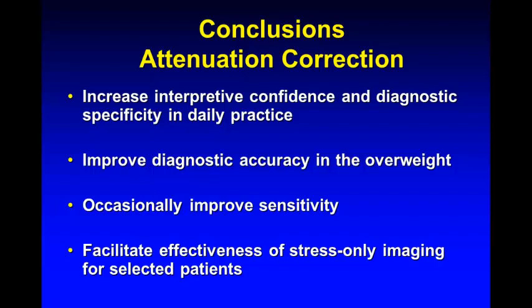So in conclusion, attenuation correction does increase interpretive confidence and diagnostic specificity in daily practice. There is improved diagnostic accuracy in the overweight, which we have no shortage of here. Occasionally improved sensitivity, but this is not the main benefit of that. And it does facilitate the effectiveness of stress-only imaging for selected patients.